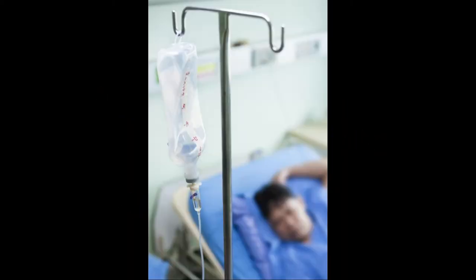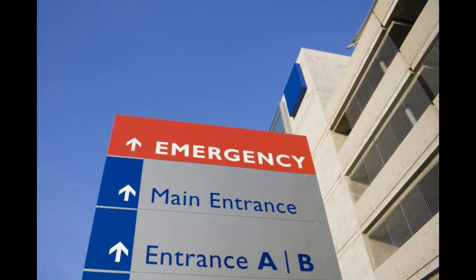What is a Toomey syringe? A Toomey syringe is used for irrigating and evacuating during medical procedures. The basic syringe has a blunt tip which can be fitted with a cap or used as is. This design can also be useful for activities like tube feeding, where it can be snapped onto the tube to deliver a nutrition bolus. Medical supply companies make a range of sizes with interchangeable tips for different applications, and they are available over the counter in many regions.